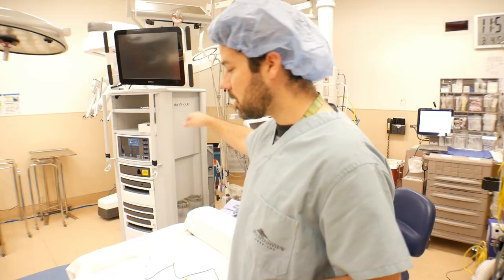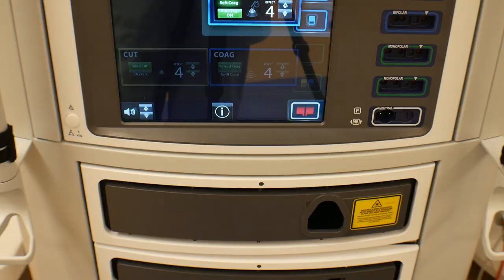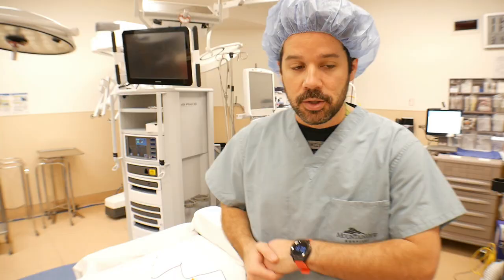Over here we have our robotic console. When you buy a robot it comes with the surgeon's console, the robot, and this huge tower, and inside this tower we have hookups for two monopolars and two bipolars. So these generators can come in all shapes and sizes.